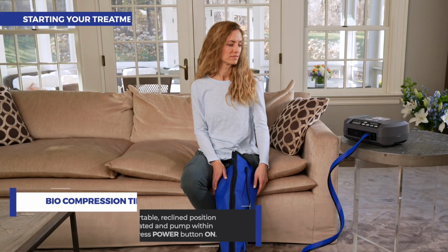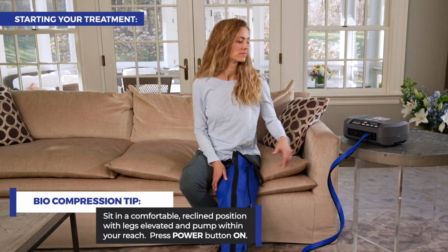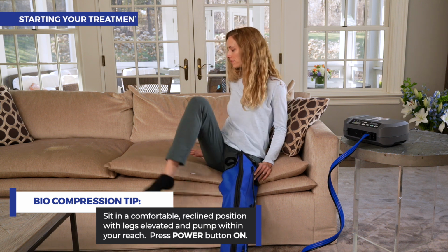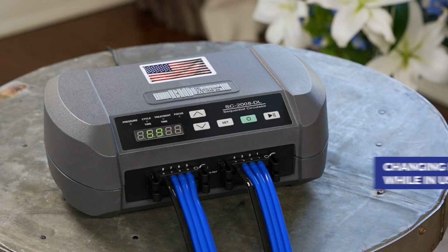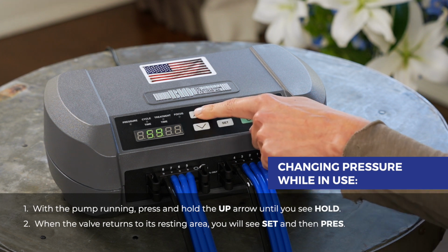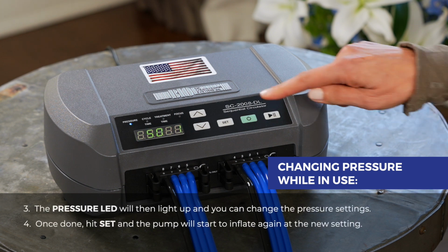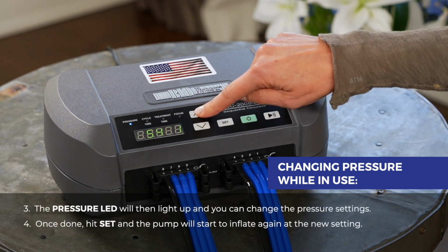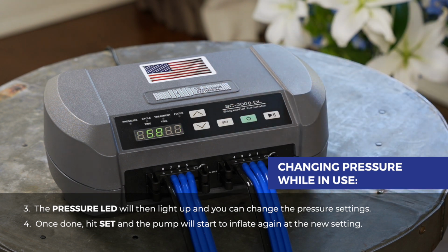Starting your treatment, sitting in a comfortable reclined position with your legs elevated and pump within your reach, press the power button On. The settings will appear on the LED display and the pump will start. To change the pressure setting on your pump while in use, with the pump running, press and hold the up arrow until you see Hold. When the valve returns to its resting area, you will see Set and then Press. The pressure LED will then light up and you can change the pressure settings. Once done, hit Set and the pump will start to inflate again at the new setting.